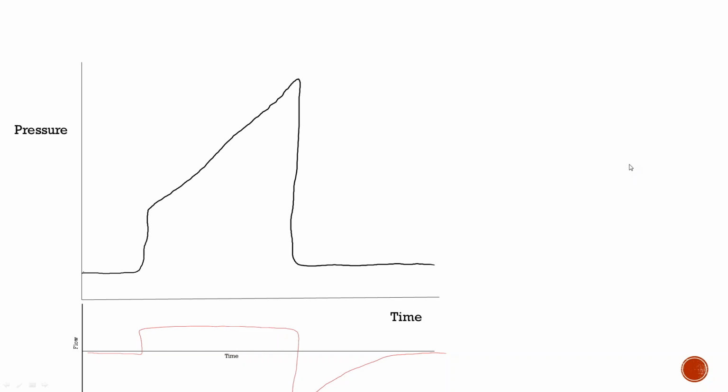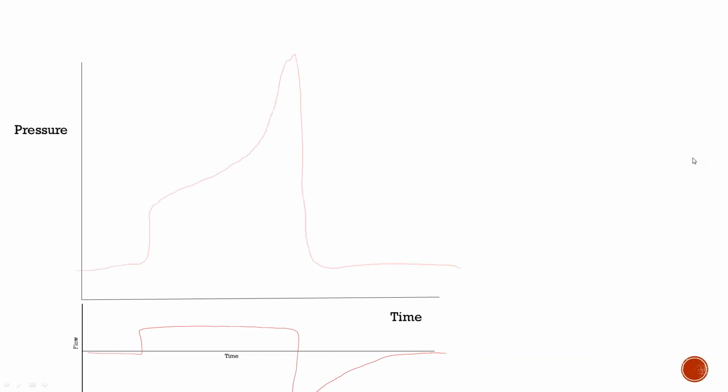Okay, so let's look at another breath. I don't know everyone that walked in, but let's go with Lionel, since I know you. Can you say what's wrong with this breath, or if it's correct? Compared to the previous breath, the slope of the inspiratory side is a little bit more bent.